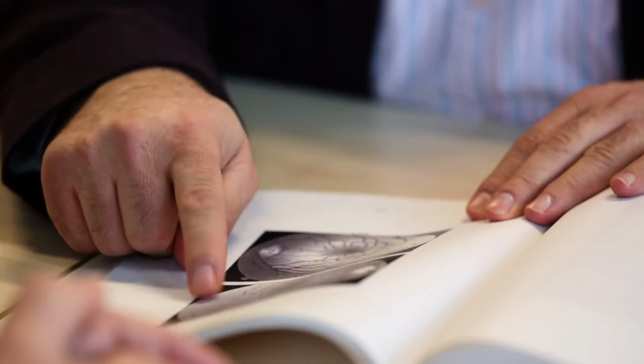The aim of the research is to extract and measure retinal blood vessels from retina, and to study the changes that happen to these blood vessels due to different types of diseases, such as diabetes and hypertension.